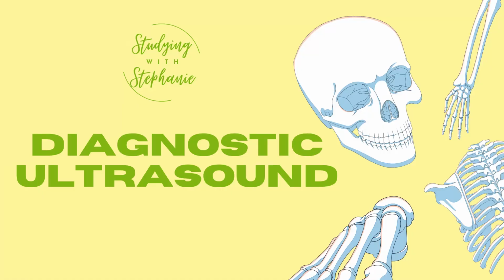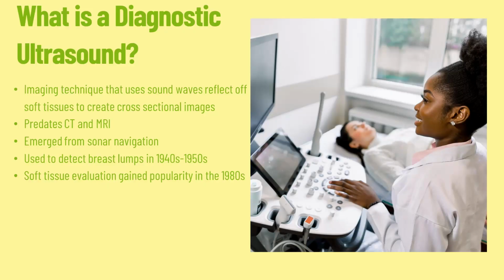Today we're going to continue our series on diagnostic imaging, and we are going to discuss diagnostic ultrasound. So let's get into it. So what is ultrasound? Ultrasound is a machine that uses crystals to create a vibration, therefore creating sound waves that penetrate the tissue and create a cross-sectional image.